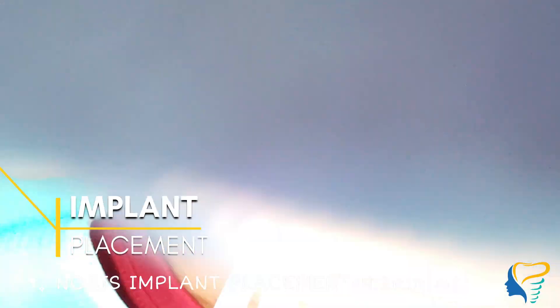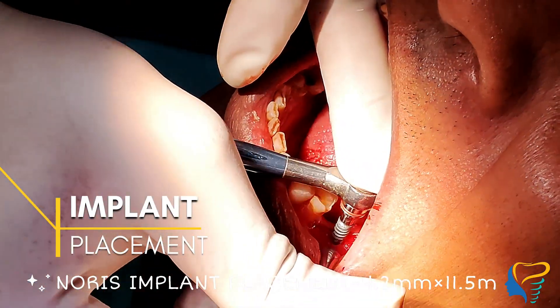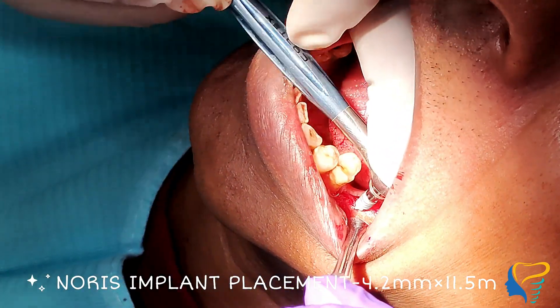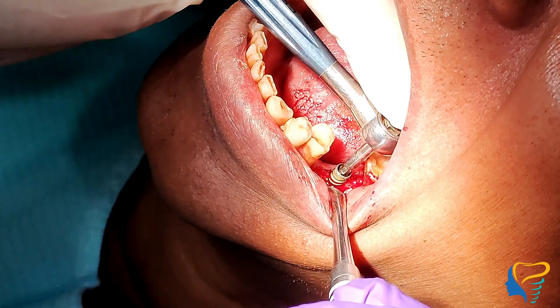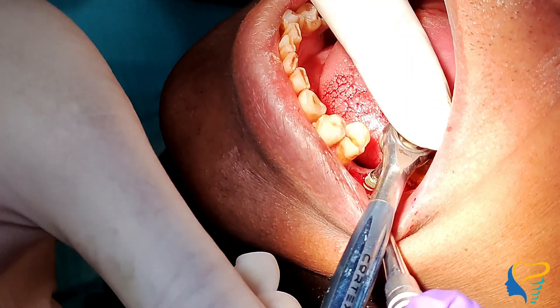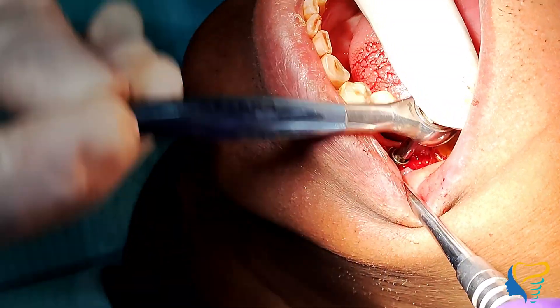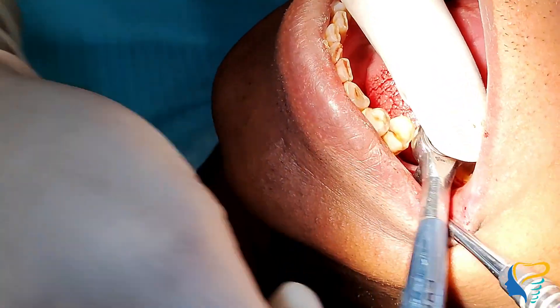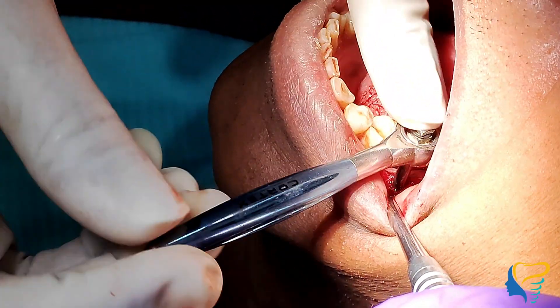Now comes the main part — implant placement with a torque wrench, maintaining apical distal pressure. Initially we see some resistance because we under-prepared the site. Driving the implant deep into the osteotomy site — you can place it sub-crestal or equi-crestal. Here I placed it 1 mm sub-crestal, anticipating future bone loss of 1 to 2 mm.